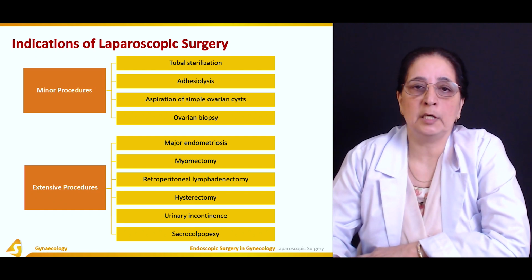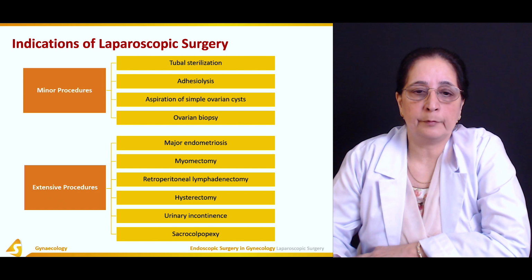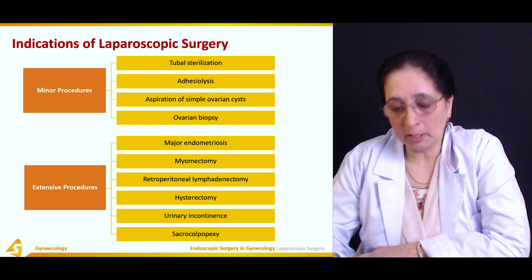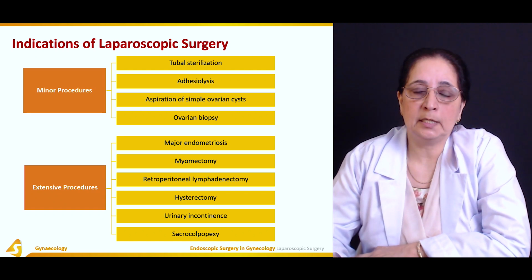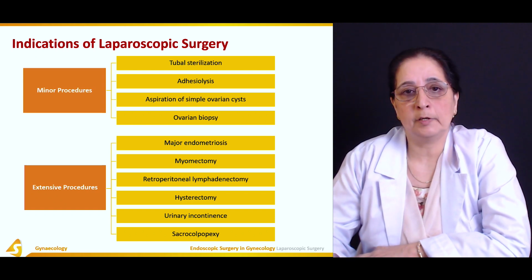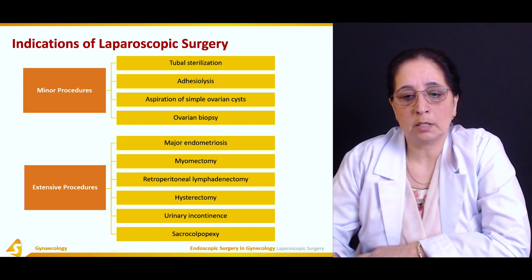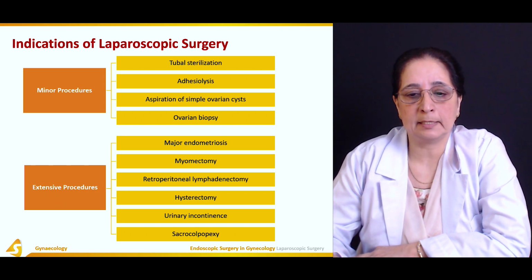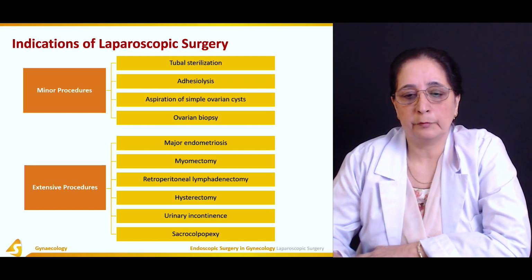So a lot of procedures are now done by laparoscopic surgery. The use of laparoscopy decreases the cost of the surgery, increases fast recovery, and means less hospital stay. So it is very, very effective to use laparoscope in different surgical procedures.